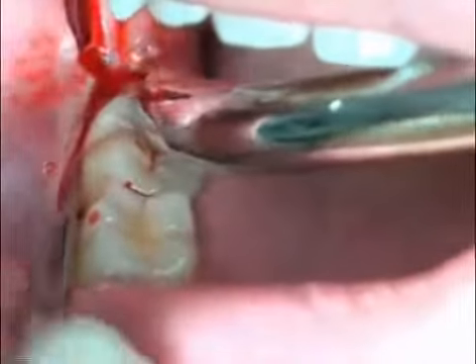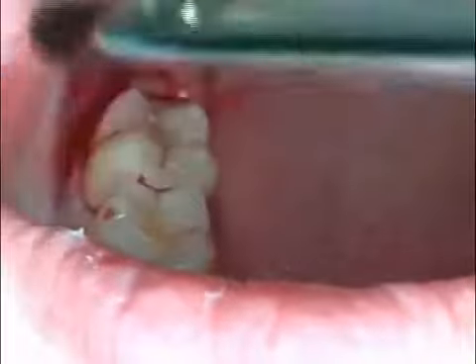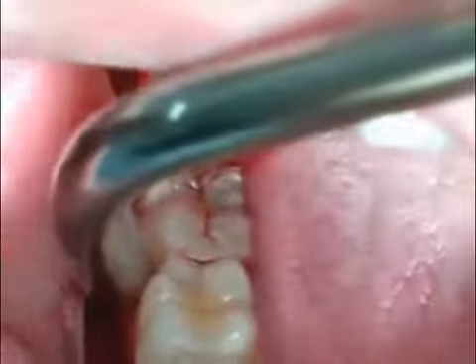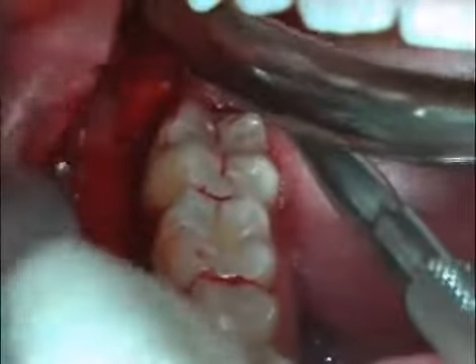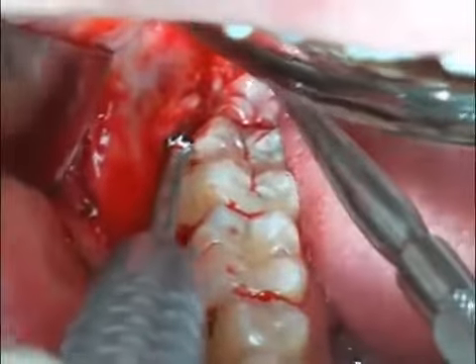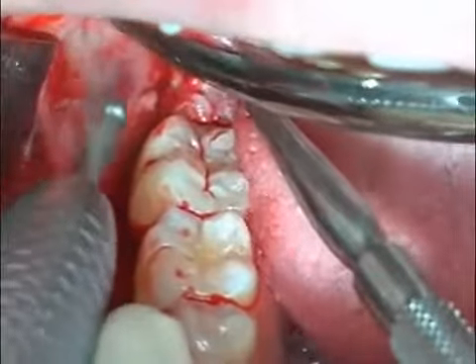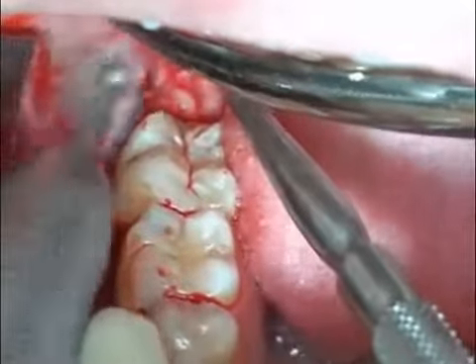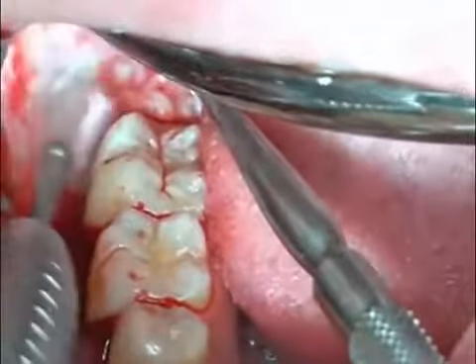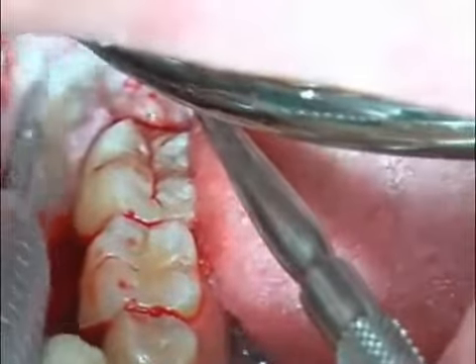When doing so, a so-called gingival margin cut is made along the ascending branch of the lower jaw and on the number 7 tooth. You can find out more in the video entitled Gingival Margin Cut. The gums are moved to the side with a raspatory, and thus the mucous membrane, including the periosteum, is lifted off the bone. A wide raspatory is placed underneath the periosteum in order to protect the other soft parts, such as, for example, the lingual nerve, because the bone is now removed with a drill.